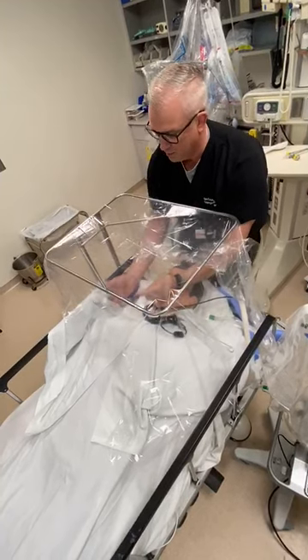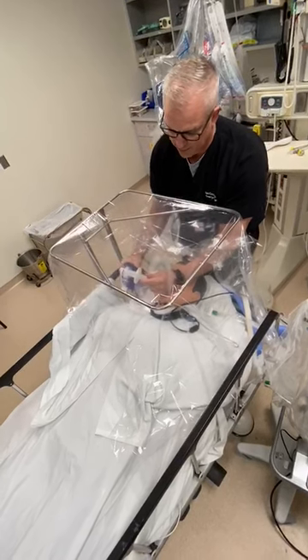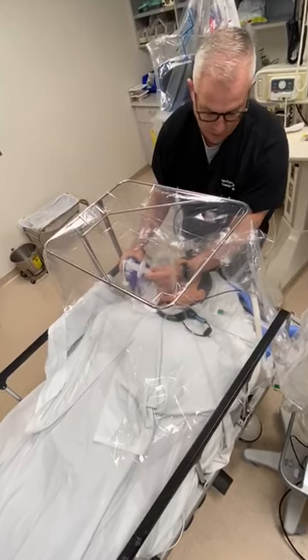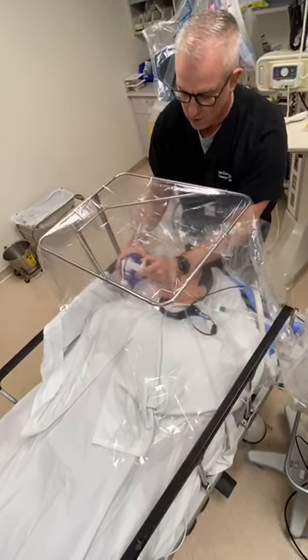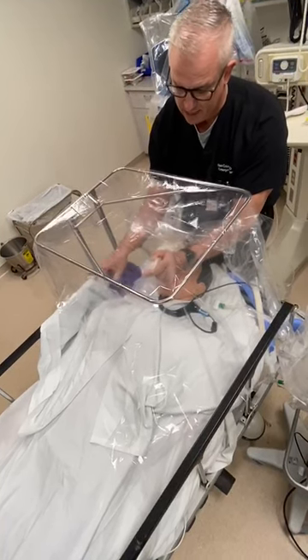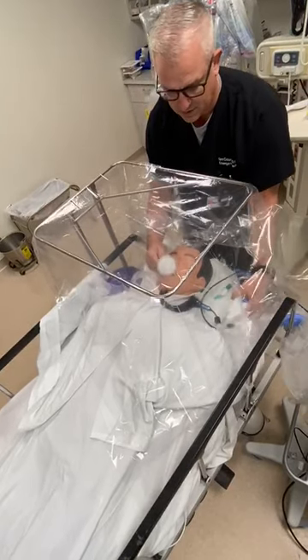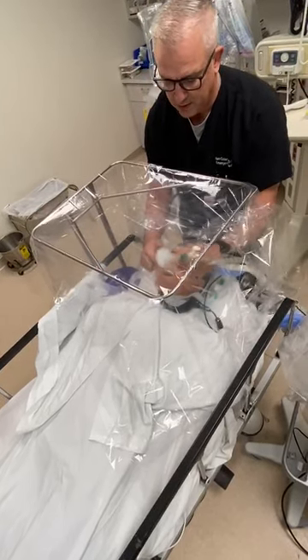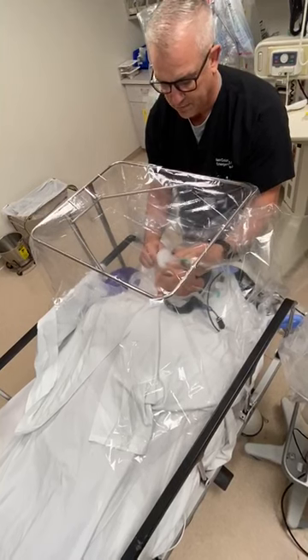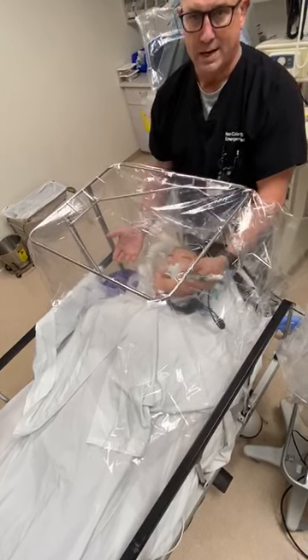Then you want to bag the patient until you're sure you've got it where you want it. Once you're ready, put the patient on the ventilator — take off your bag and switch over to your ventilator tubing. Again, all of this is underneath the tenting material. Once you've got that patient on the ventilator, you've got a closed system and then you can start breaking down your tenting material.